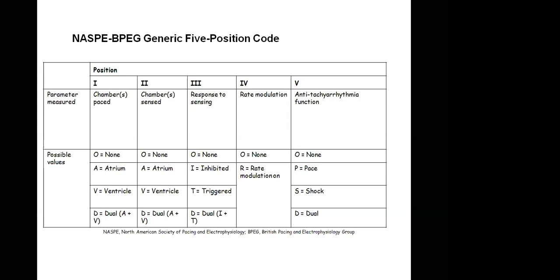I get your question, no problem. When you're doing your programming, there is a time interval, just like your PR interval. There's also something on the machine that mimics a PR interval. If I get the name, I'll let you know.